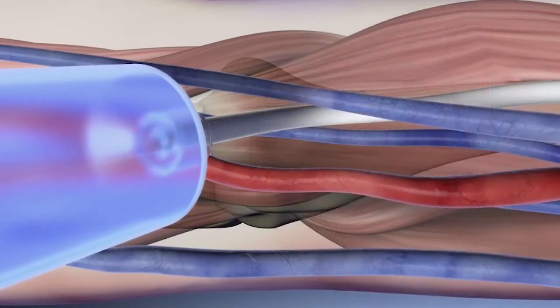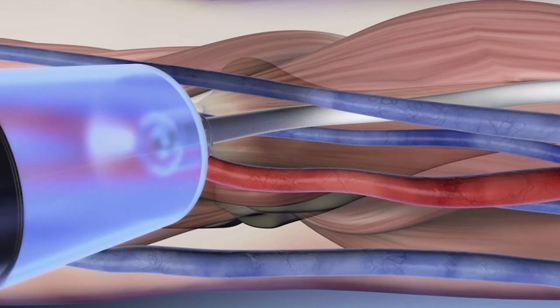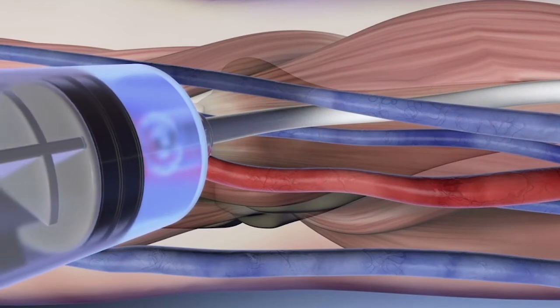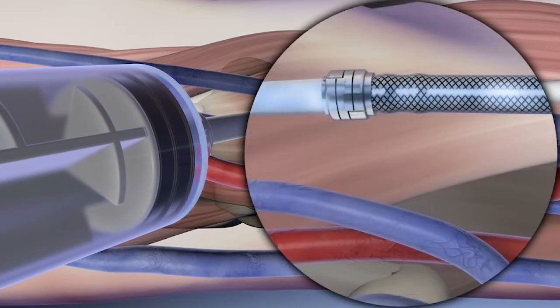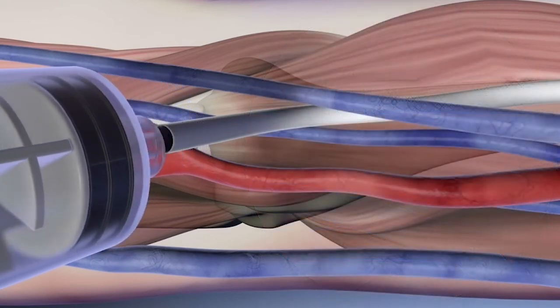Using a syringe adapter, attach a syringe to the graft and flush with heparinized saline. Verify no leakage occurs at the DPG site and re-clamp.